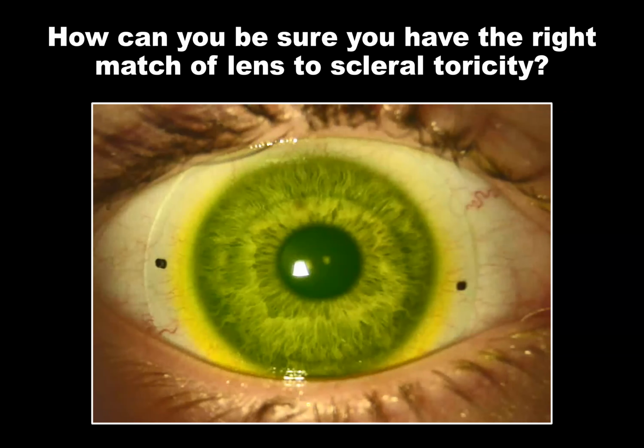That is such an important point, Felipe, that this research has shown that the corneal astigmatism and the scleral astigmatism do not typically match up. In our studies at Pacific University, we found that only 20% of the time did the corneal and scleral toricity match. So in other words, your flat meridian, where these markers are, can be almost any axis 360 degrees around. The markers may be anywhere depending on where the flattest meridian of the sclera is.